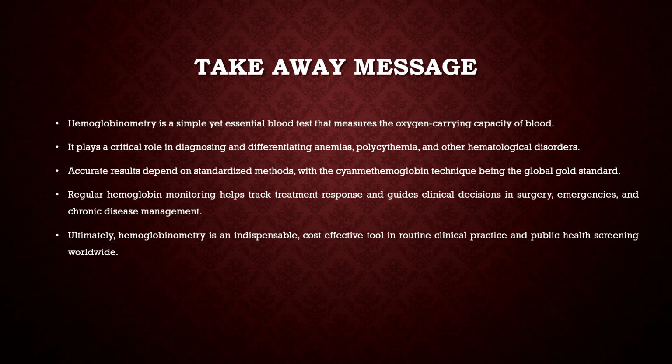Last but not the least, this is the takeaway message. Number one, hemoglobinometry is a simple yet essential blood test that measures the oxygen carrying capacity of the blood, because we all know that hemoglobin is the only way to carry oxygen throughout the blood. Next, it plays a critical role in diagnosing and differentiating anemia, polycythemia, and other hematological disorders.